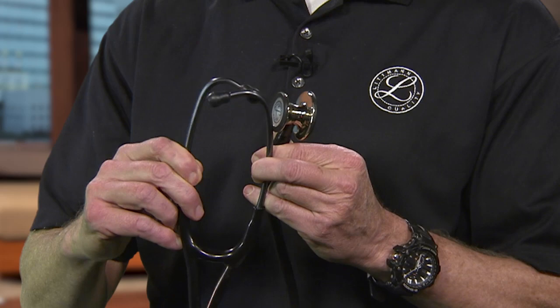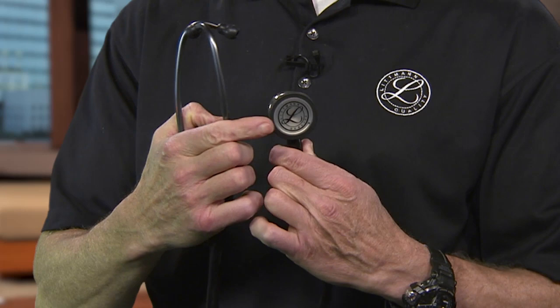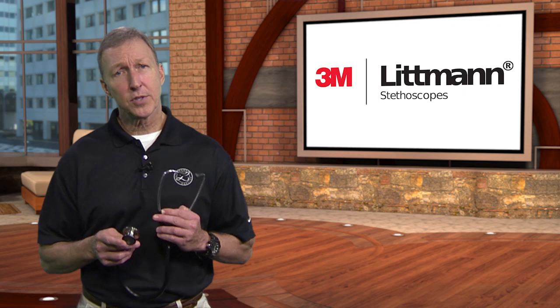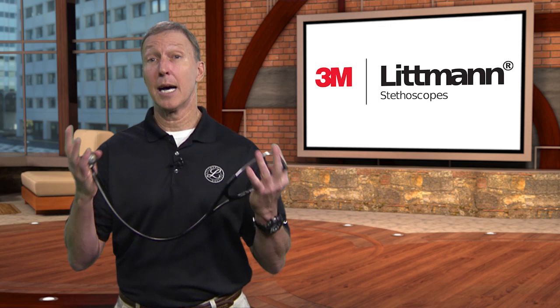On our double-sided chest piece, gently tap the diaphragm to make sure the chest piece is turned the correct way. On some models, such as the Classic 3 and the Cardiology 4 stethoscopes, look for a mark on the stem to see which side is activated — whichever side that's pointing to is the side you put against the patient's skin to listen. Our soft-sealing ear tips are smooth and provide a comfortable acoustic seal inside your ears, mushrooming out to create a seal that cuts out a lot of ambient noise.